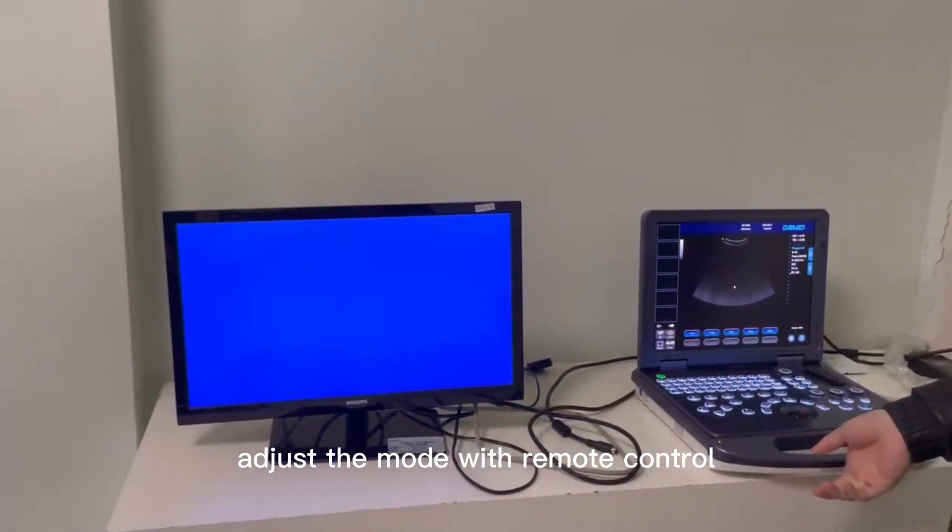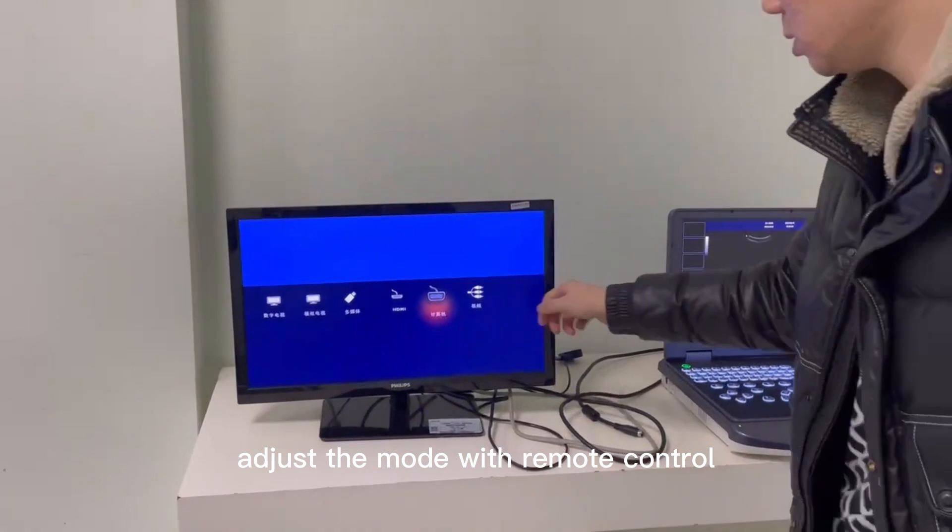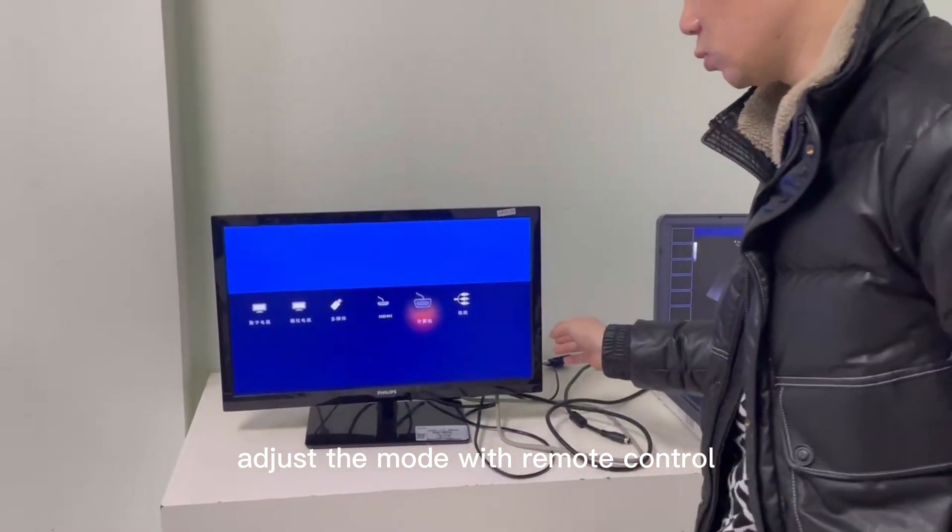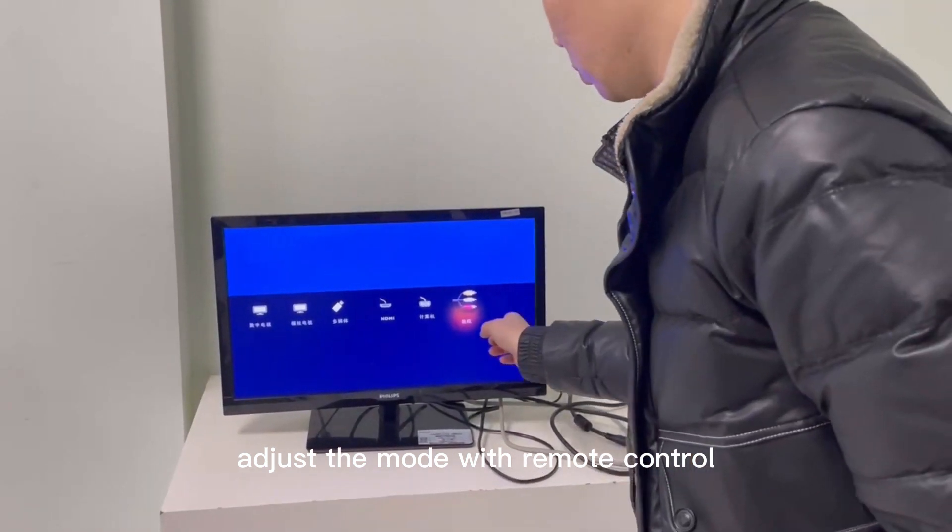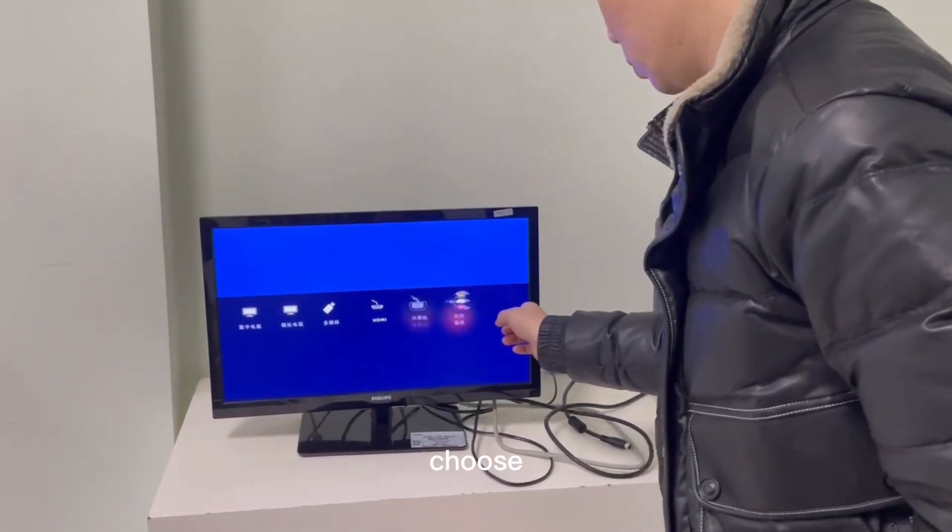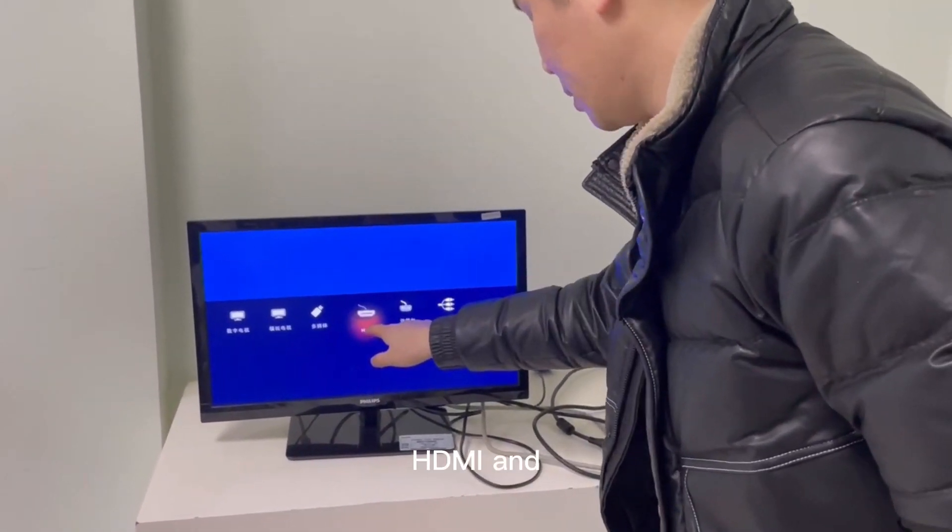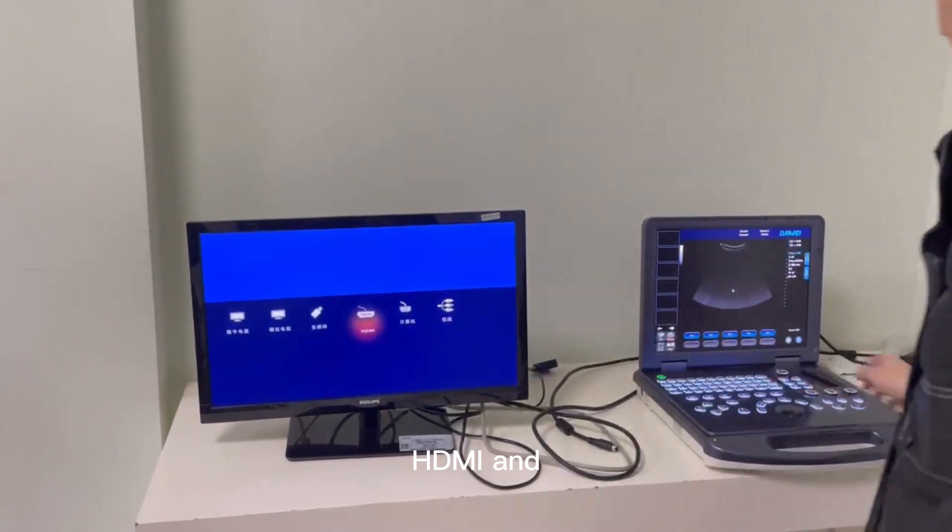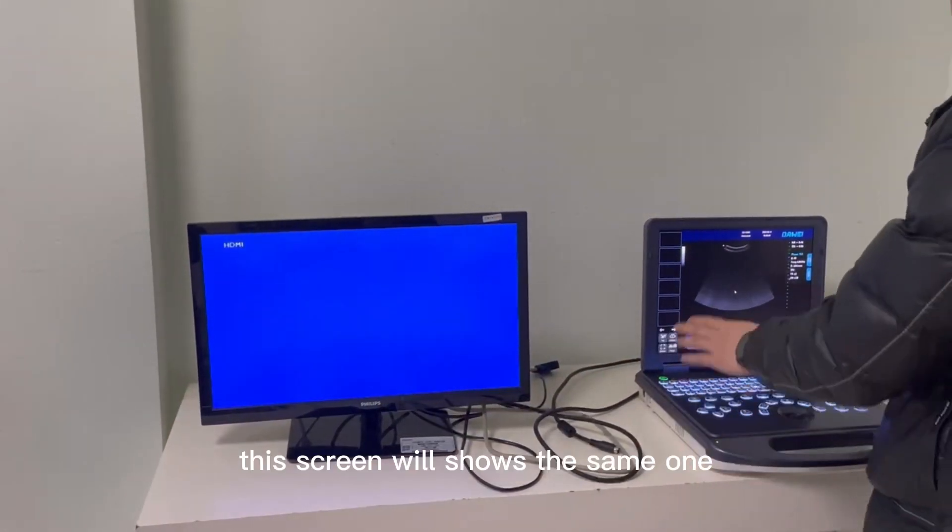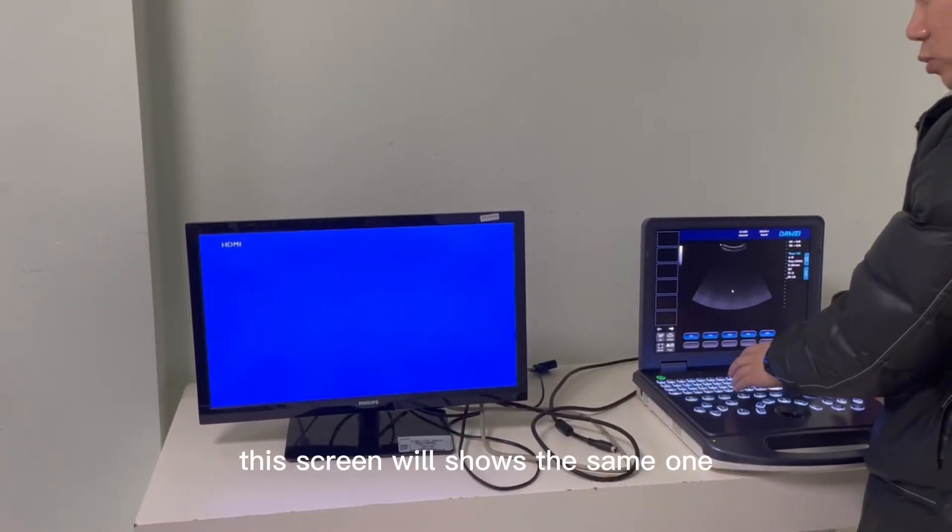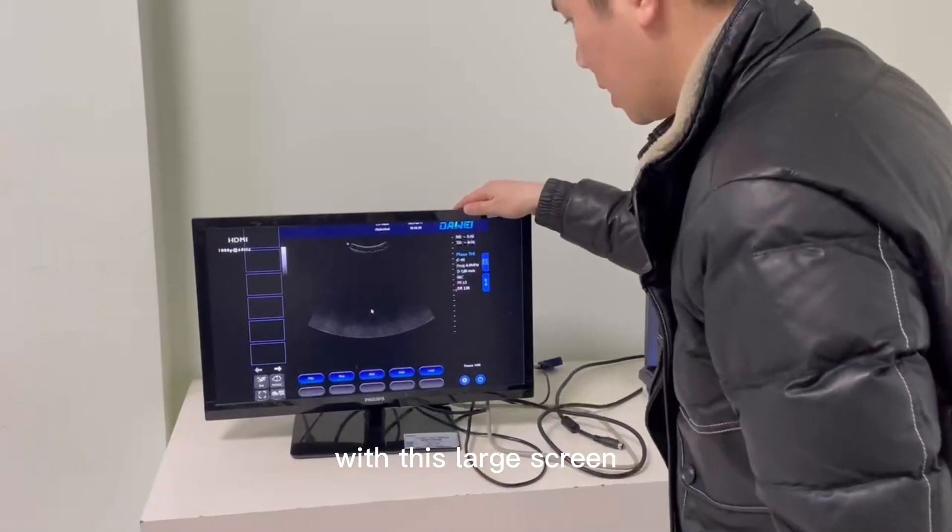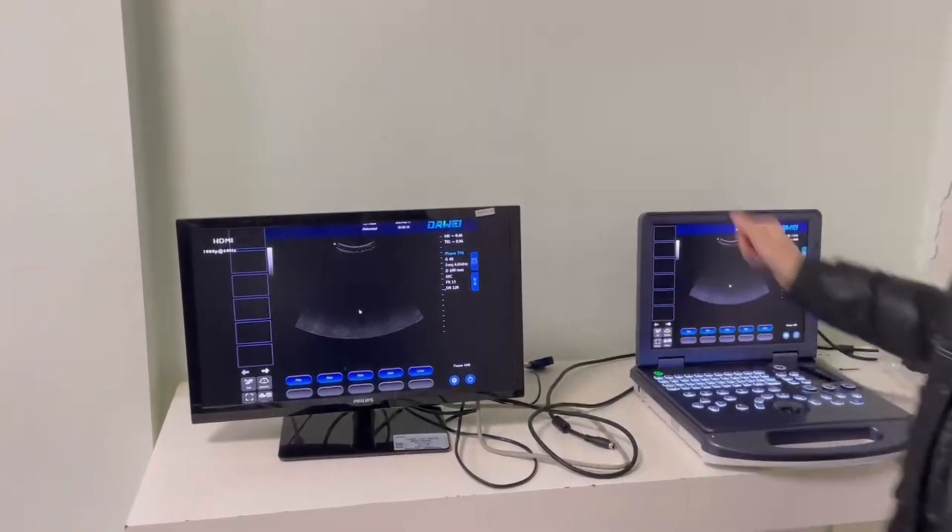Adjust the mode with the remote control, choose HDMI, and the screen will show the same image on the large screen.